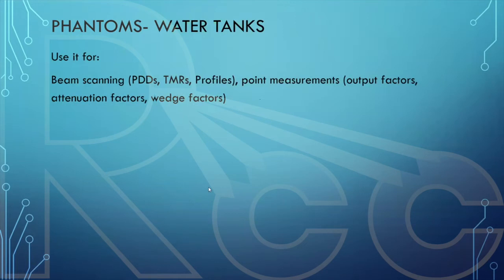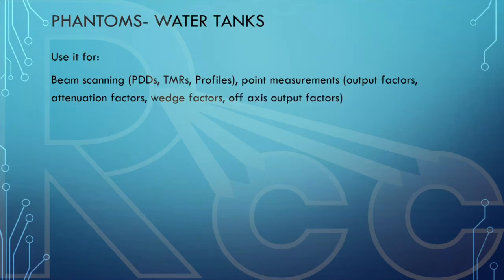So these big water tanks are ideal for beam scanning, to get your PDDs, your profiles, your TMRs. For point measurements, your output factors, especially for the big field sizes, attenuation factors, wedge factors, and of course, off-axis output factors.